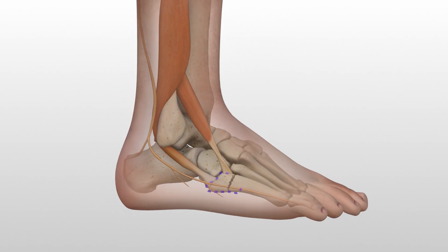The base of the fifth metatarsal is outlined, including the insertions of the peroneus brevis and tertius tendons. A small incision is made at the base of the fifth metatarsal at the intersection of the peroneus brevis and tertius tendons. Care is made to identify and protect the sural nerve branches which run over the peroneal tendons.